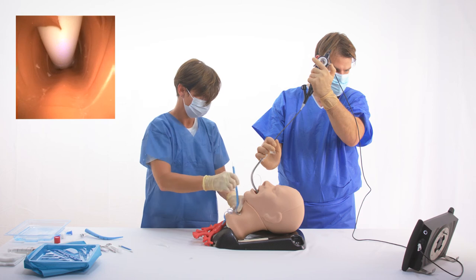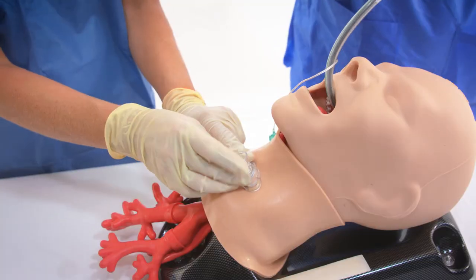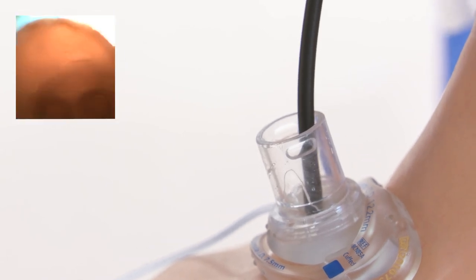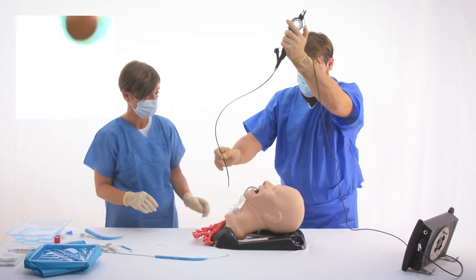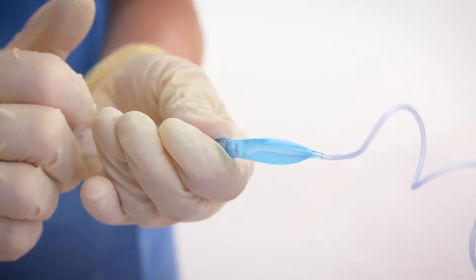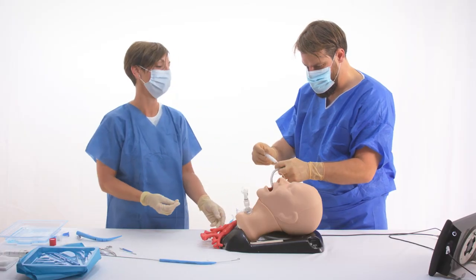The guiding catheter, dilator, and wire guide are removed, leaving the tracheostomy tube in place. The BroncoFlex is inserted into the tracheostomy tube to confirm correct placement. The tracheostomy tube cuff is inflated, the tube connected to the ventilator, and the endotracheal tube is deflated and removed.